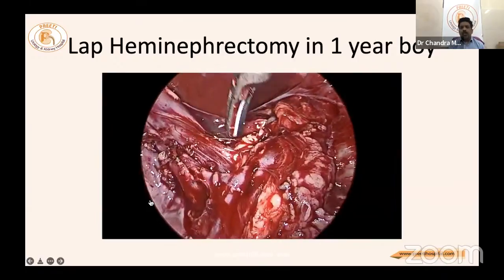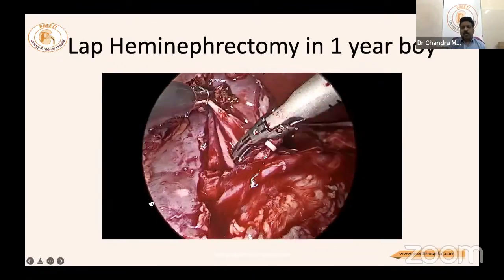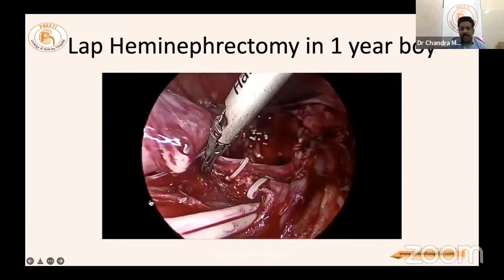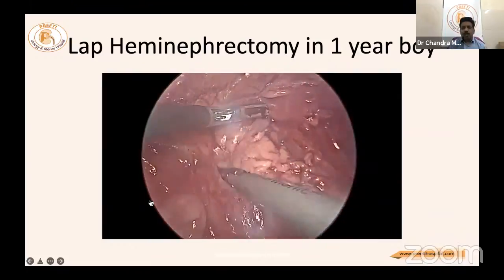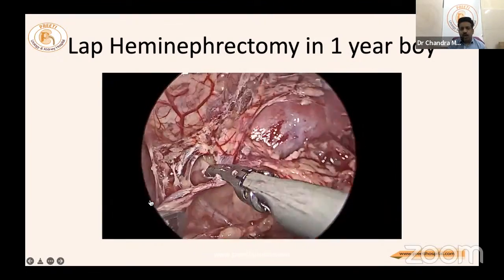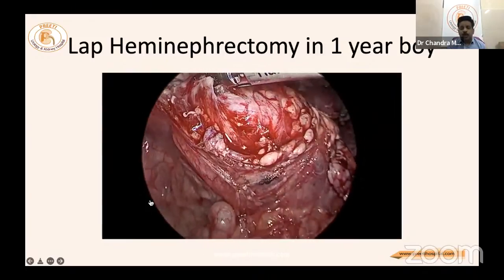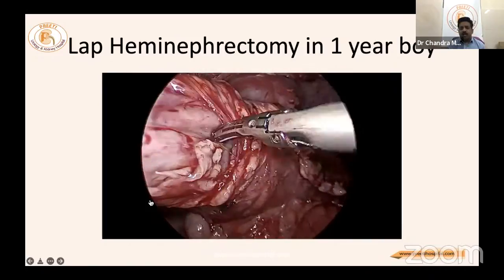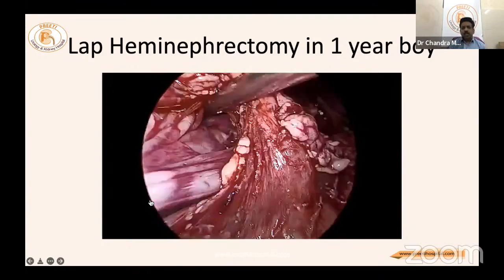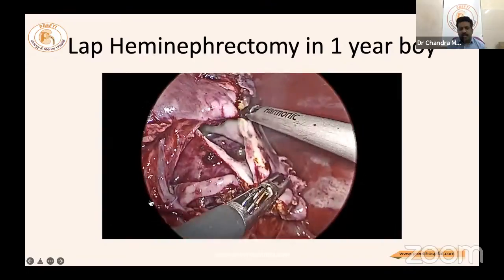The upper pole is scraped like a hydrocele — only the inner layer is removed wherever it is attached to the kidney. An important point: small vessels come to the upper pole — not big vessels — but the ureter will be very large. The dilated ureter goes behind the renal vessels. Going below the renal hilum, the native lower pole ureter is identified. The lower pole ureter must be preserved at all costs.